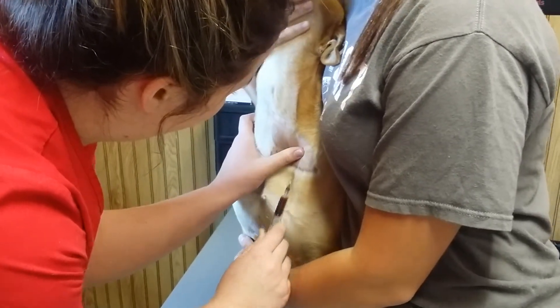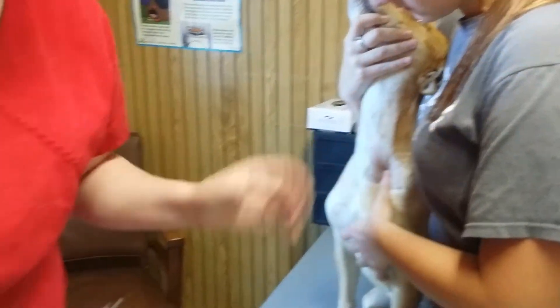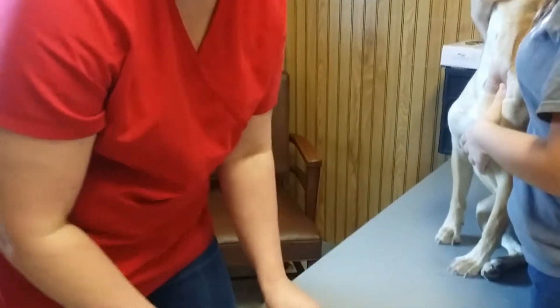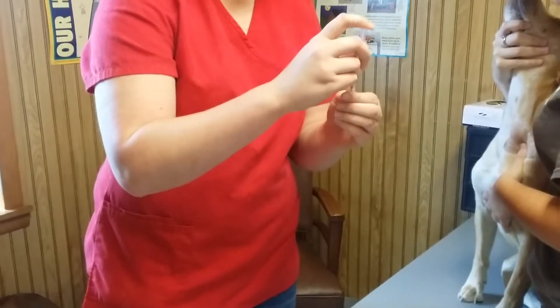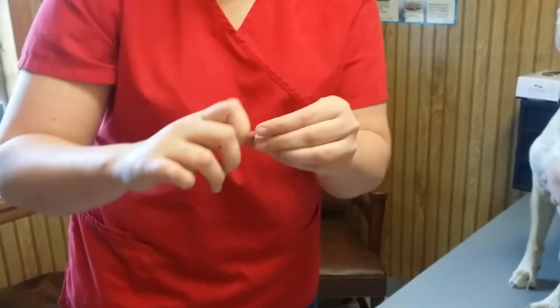I'm going to apply pressure and ask Hattie to apply pressure for 60 seconds to prevent a hematoma. And I am going to apply my blood into the blood tube. And also it is labeled correctly.